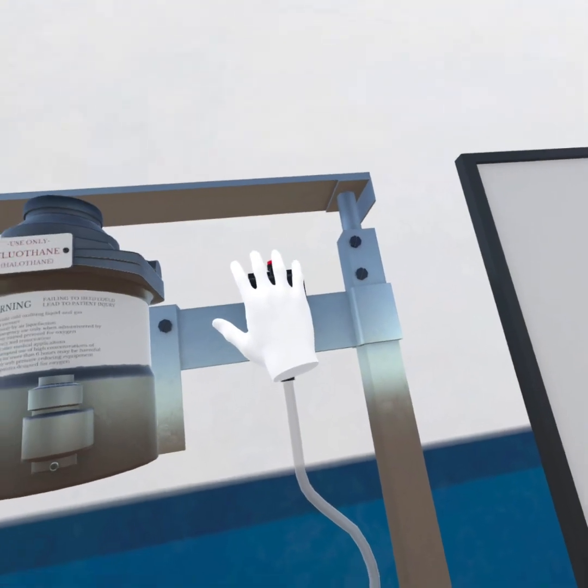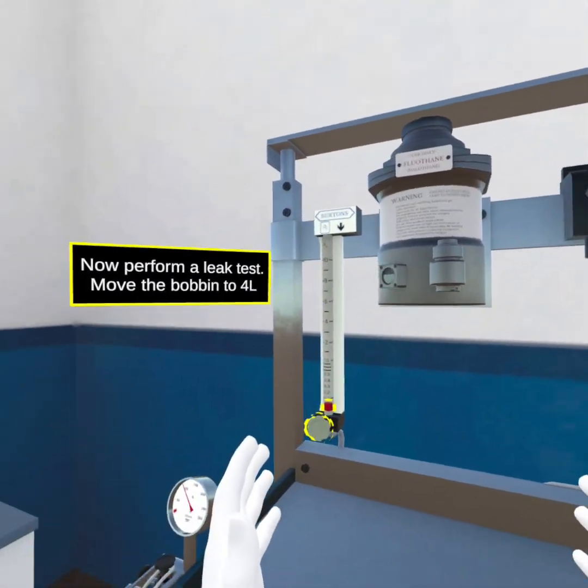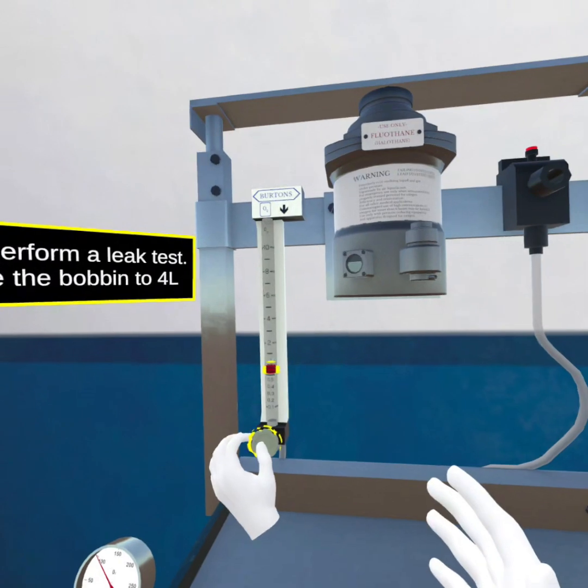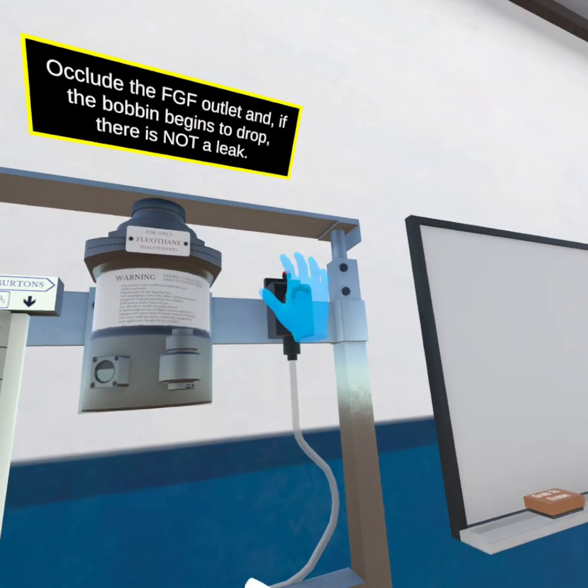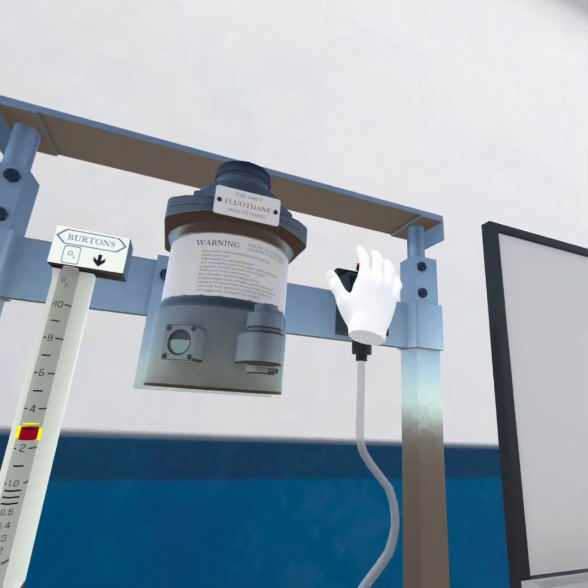Now perform a leak test. Move the bobbin to 4 litres. Occlude the FGF outlet and, if the bobbin begins to drop, there is not a leak. Reset the bobbin back to the bottom.